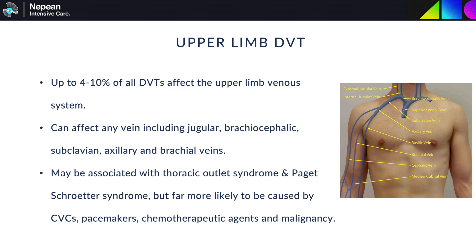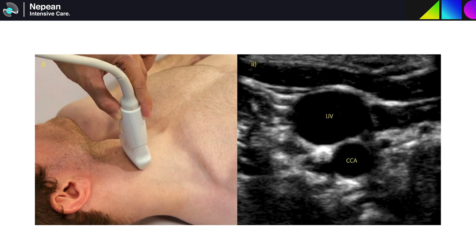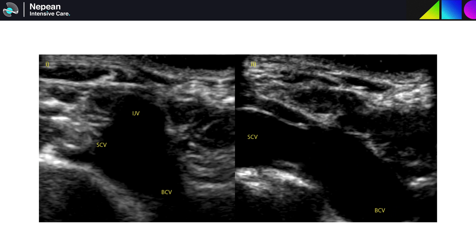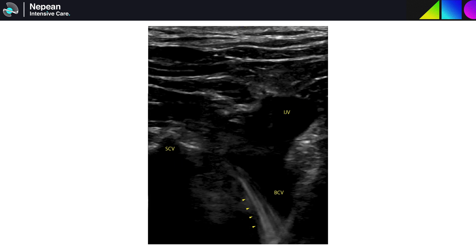We often don't really consider upper limb DVTs, but they can make up about 10% of total DVTs in our patients — a figure that's probably underestimated, particularly in our population. Due to the sternum and intrathoracic vessels, they can be much more difficult to assess, and imaging tends to rely more heavily on respiratory phasicity and flow augmentation to identify any clot. Imaging the internal jugular vein is the first point. As you follow this down into the thorax, a junction between the internal jugular, subclavian vein and brachiocephalic vein can be seen. You often need to shine the ultrasound beam into the thorax by sliding all the way down to the clavicle and tilting the tail of the probe towards you. This is also a handy view for making sure your central line wire is going towards the heart rather than sneaking into the subclavian or IJ depending on your insertion location.